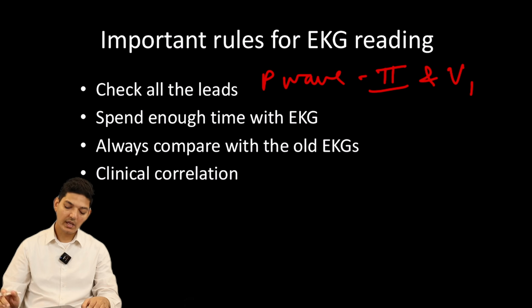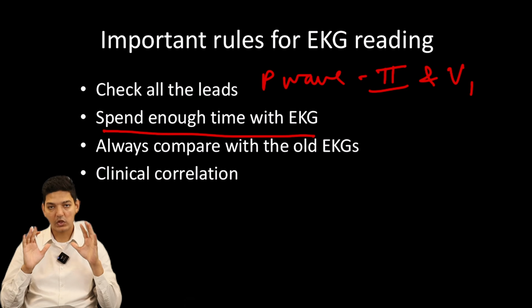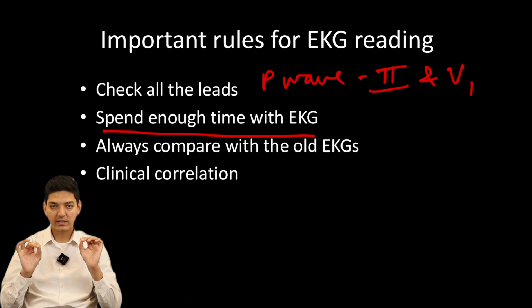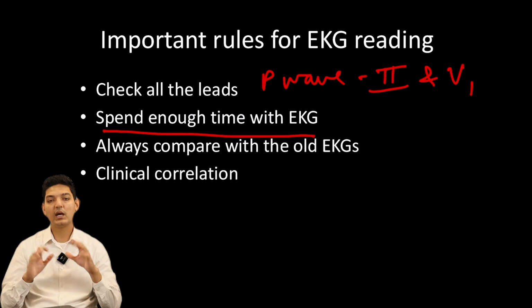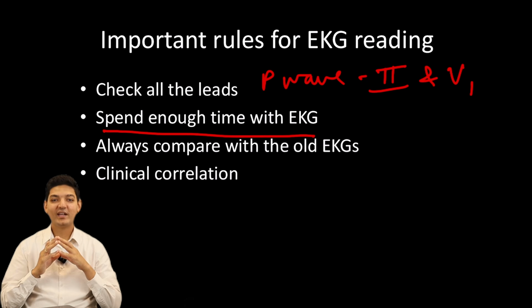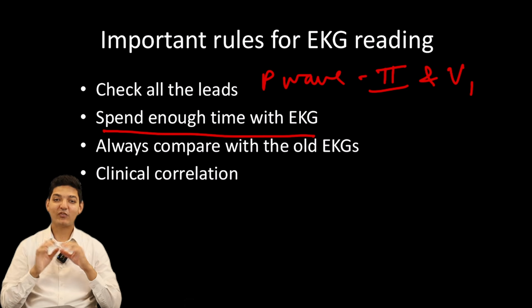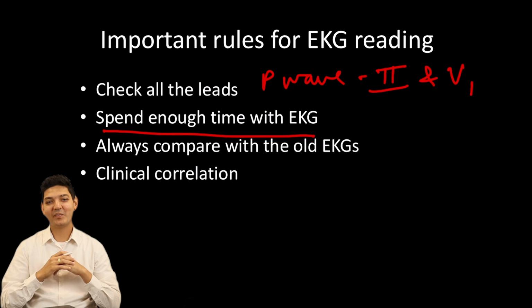That's very important. Second is to spend enough time with the EKGs. I recommend, as a new resident, spend at least 3 minutes with the EKG, and you will see how much more information you can extract. One of my mentors told me that if you want to appreciate an art, you need to look at the art for at least 10 minutes and then you can make a comment.